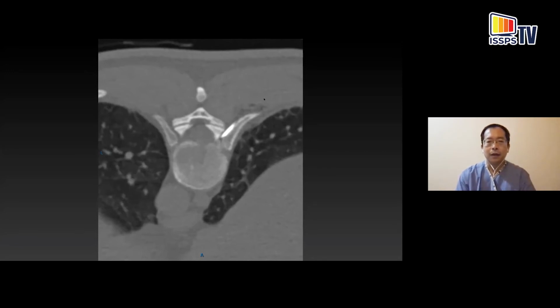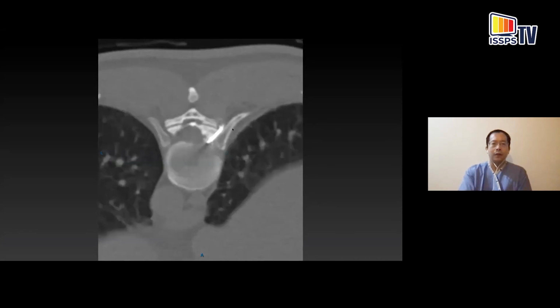Now, so here's the needle coming in. I placed it first in the TVPS, so I used ultrasound guidance to nip the needle just under the transverse process and hydrodissected a little bit to give me a bit of clearance, and then I inserted the nucleoplasty needle with a curved tip. And here, if you can see around it, this has been washed away, unfortunately.